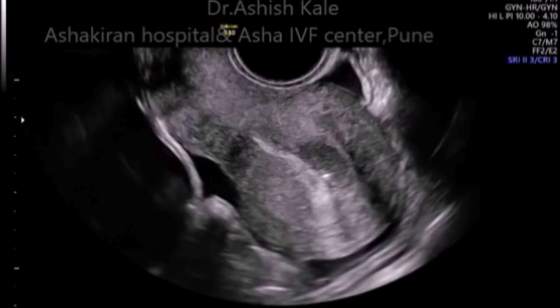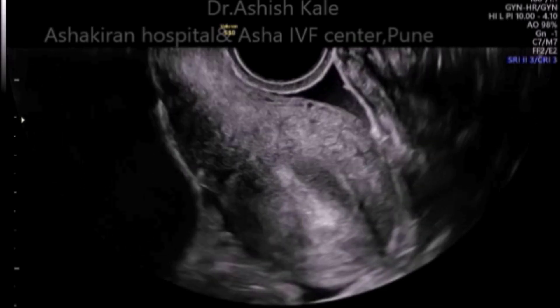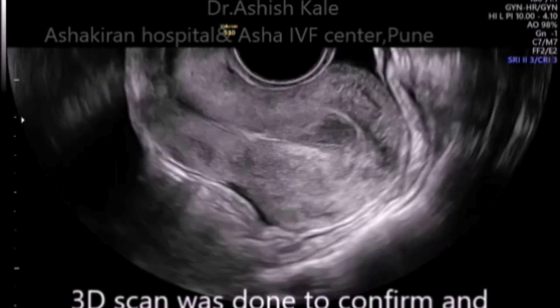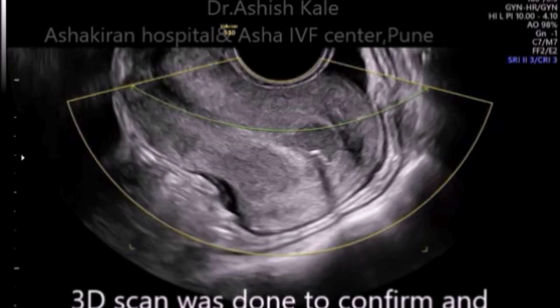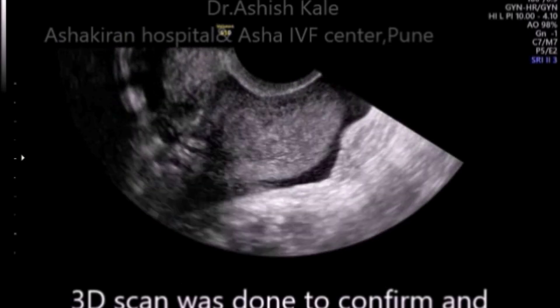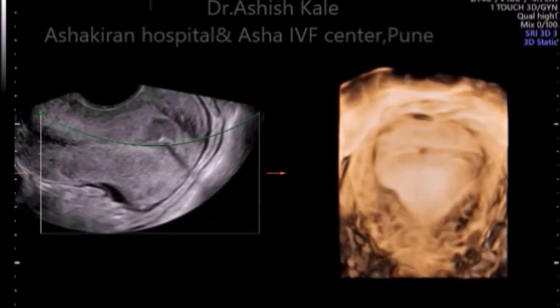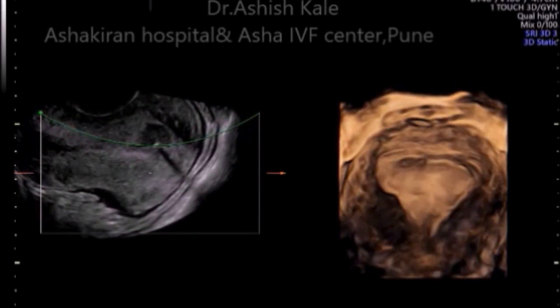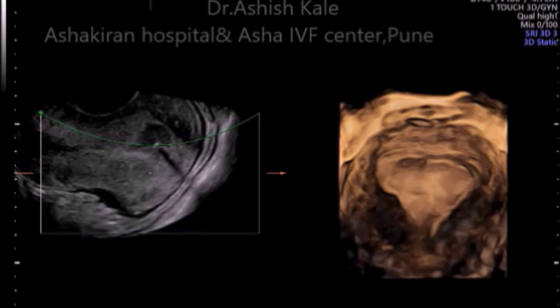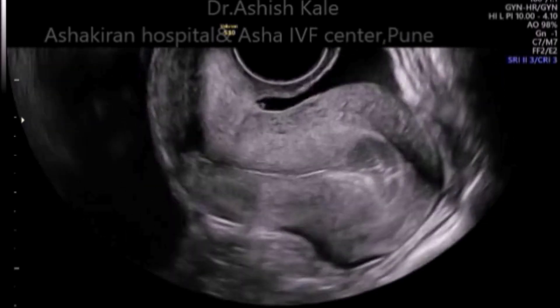After the embryo transfer, we routinely perform 3D ultrasonography to confirm placement. We do not directly visualize the embryo — what we see on ultrasound is the fluid droplet or acoustic artifact appearing as a bright white spot, which we document. After rendering the 3D views, we can determine exactly where the fundus is and where the deposit has been placed. In this case the distance is 2.4 centimeters, exactly in the center of the cavity — this is how we handle difficult embryo transfers, as we have been doing for the last 15 years.